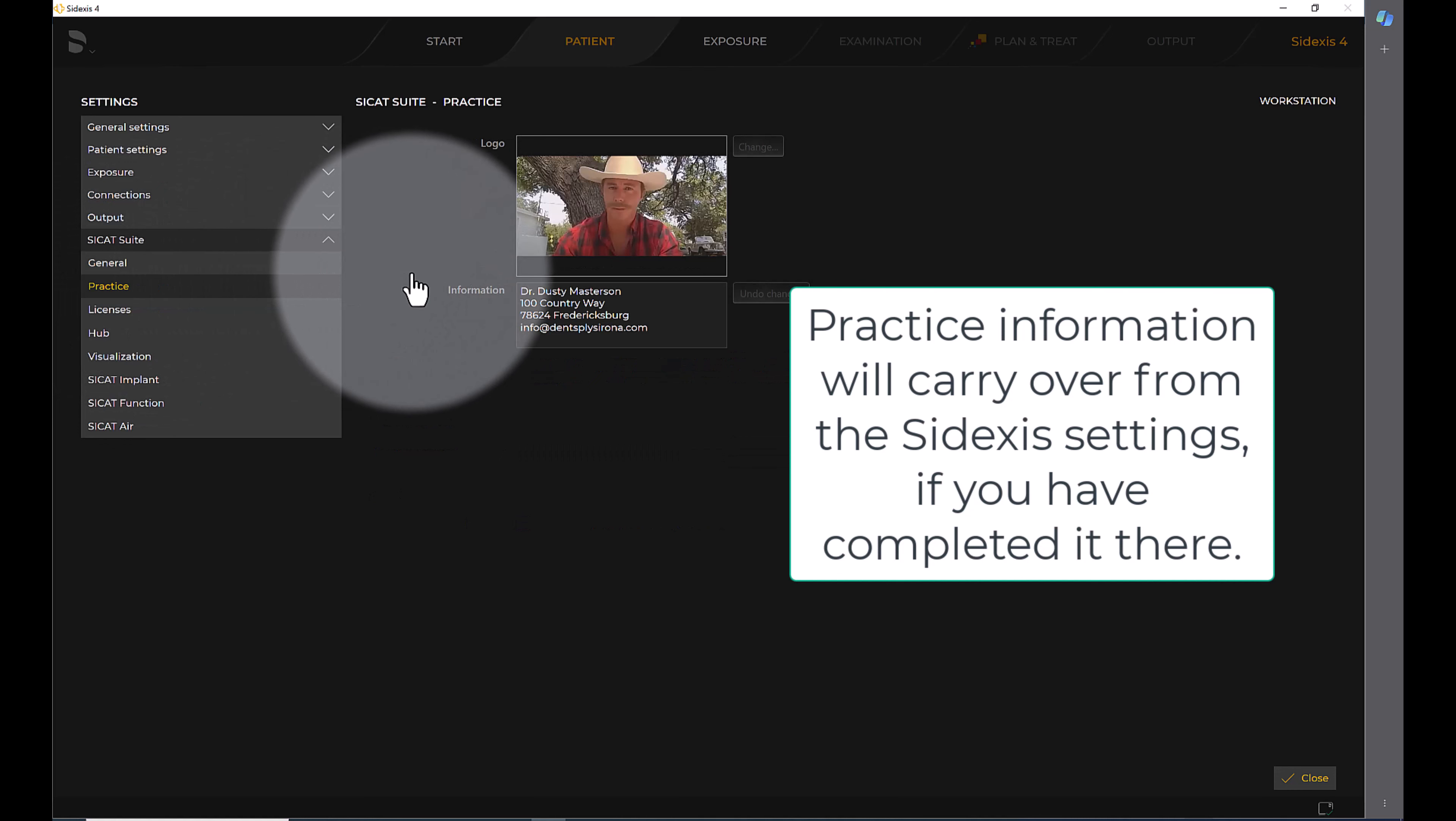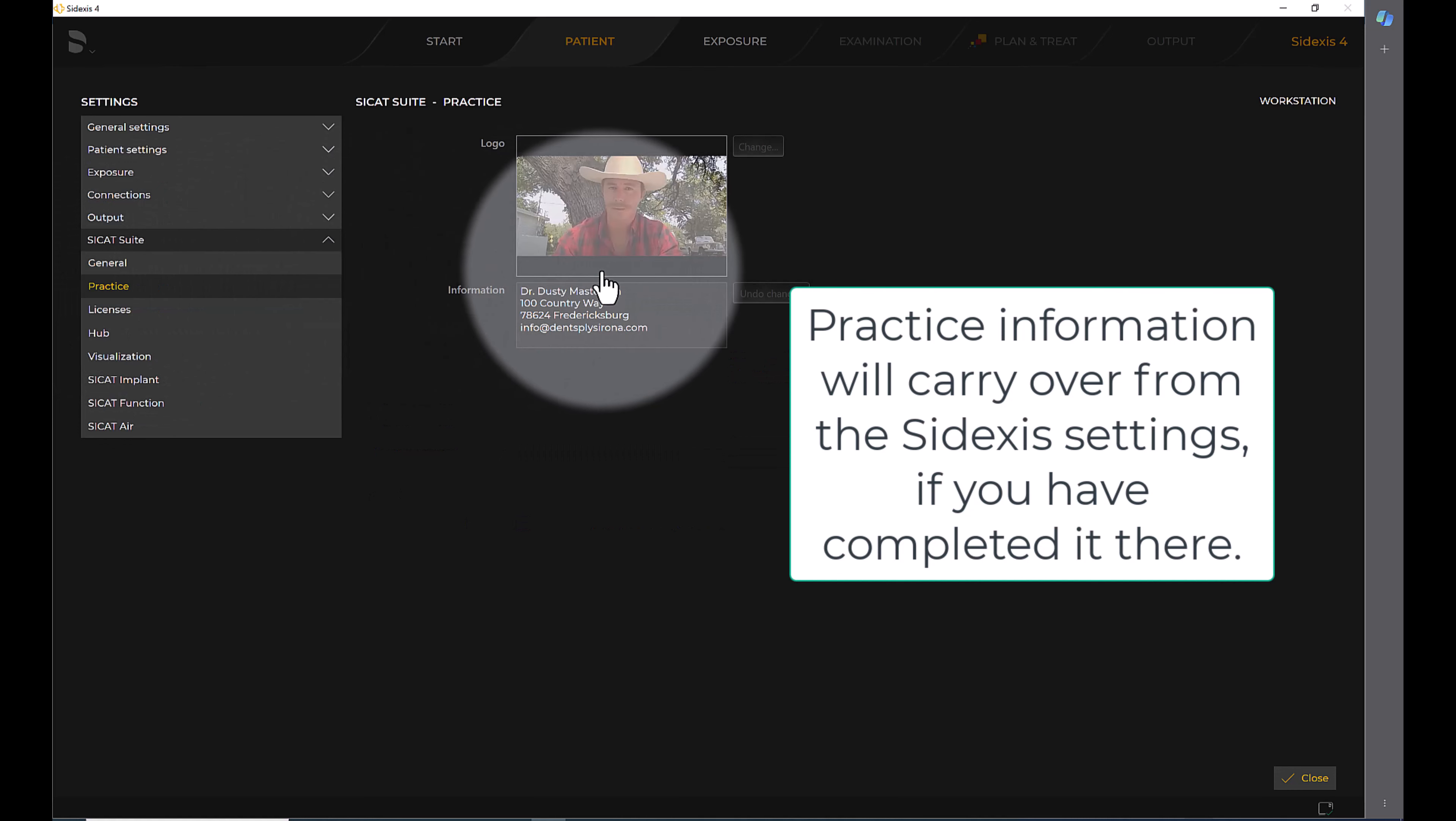Practice information will carry over from the site access settings if you have completed it there.